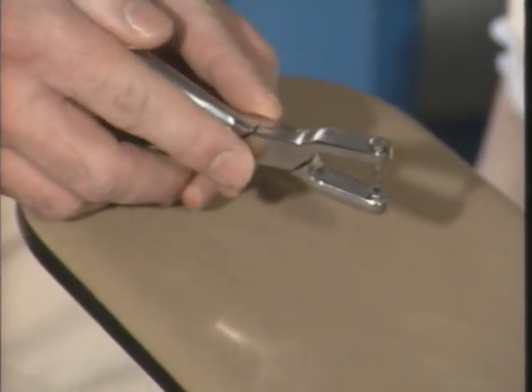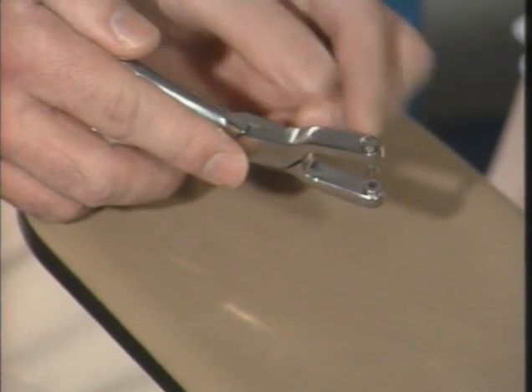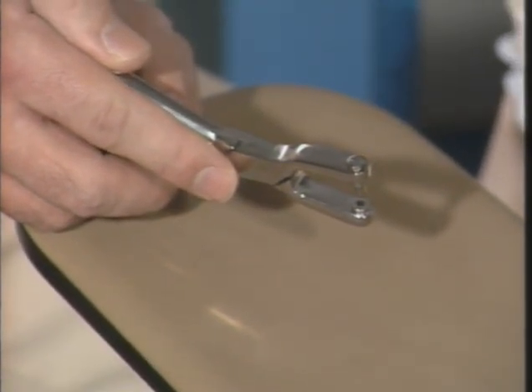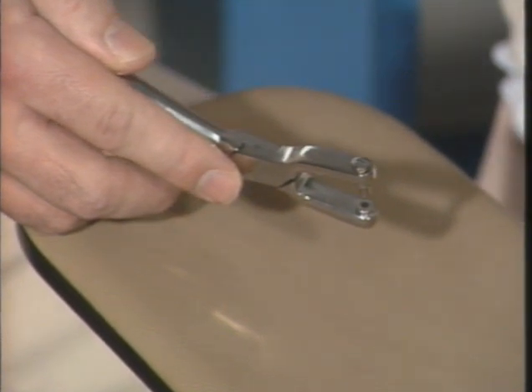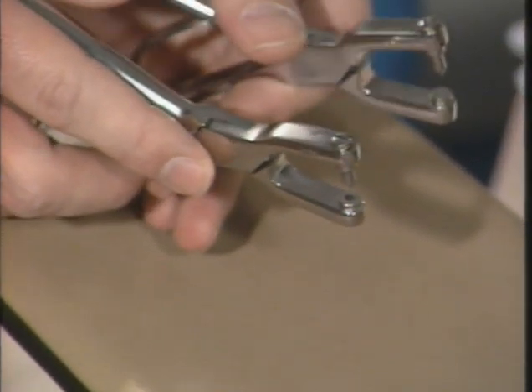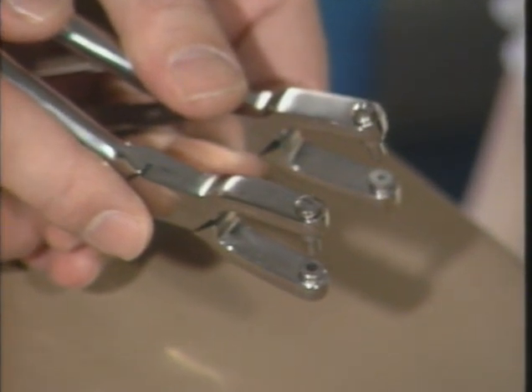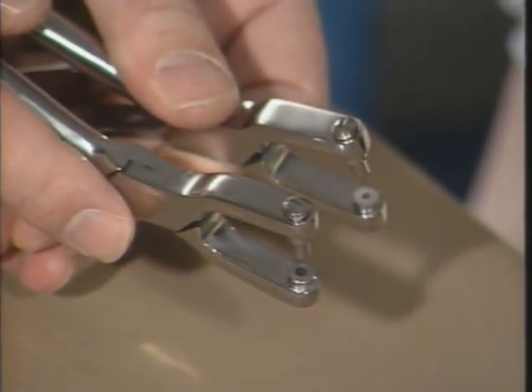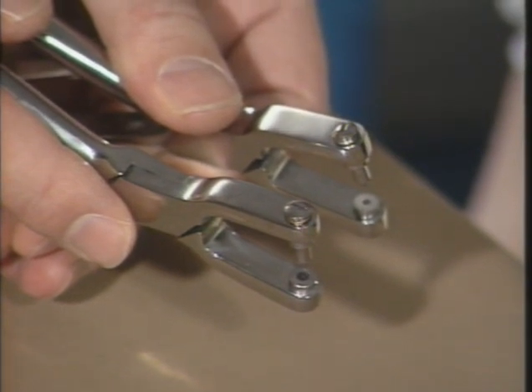To create the holes in the dam, you'll need to use a rubber dam punch. And for this, it's probably best to use a fixed table punch, because if there is no movement in the table, then you can cut a much cleaner hole very much more precisely. These punches therefore come in two sizes. The larger hole is the one that you would use for most situations, and the small hole where you have small incisor teeth which may be more closely packed together.